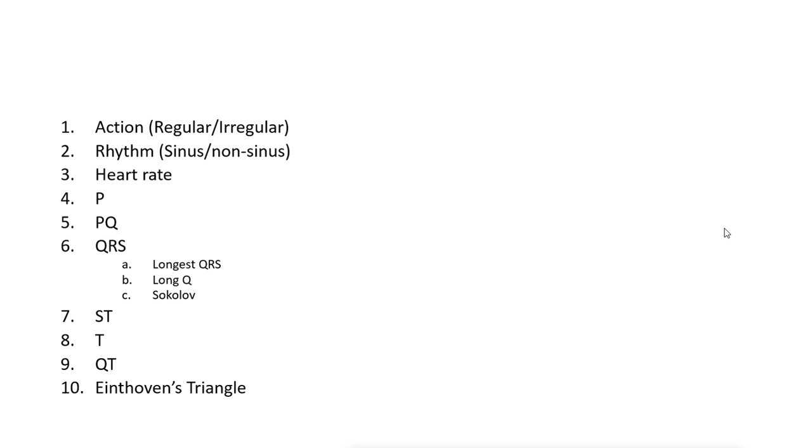It's a paper which contains the description of how to describe an ECG, and includes these 10 steps and basically how you tackle each of them. You should already have some knowledge of ECG, maybe even practiced a few questions if you find that helpful, and then come back. The goal here again is to help you avoid making game-breaking mistakes.